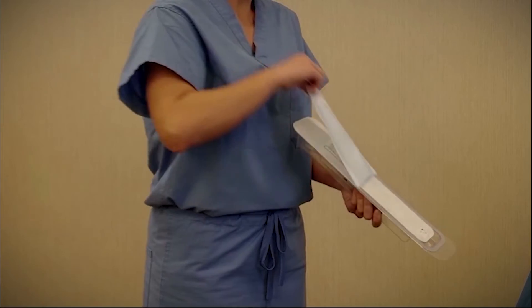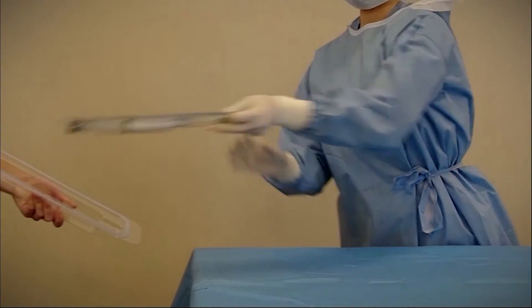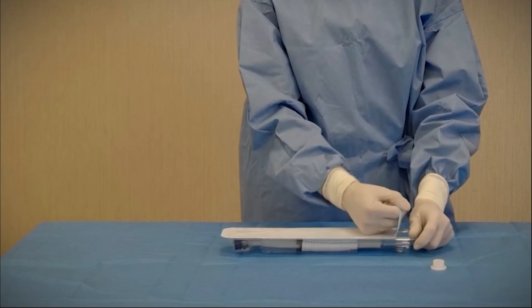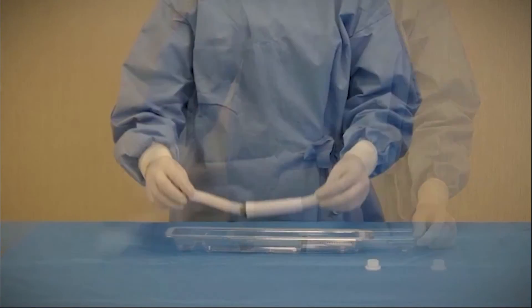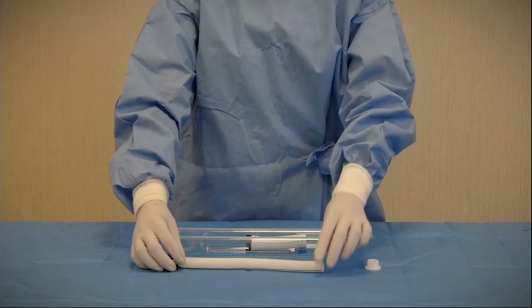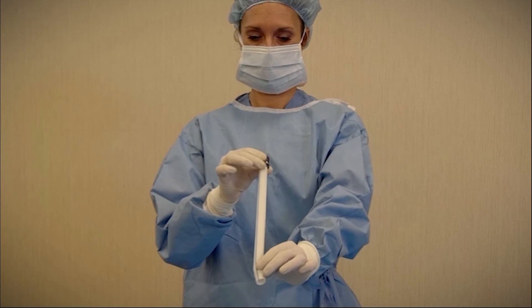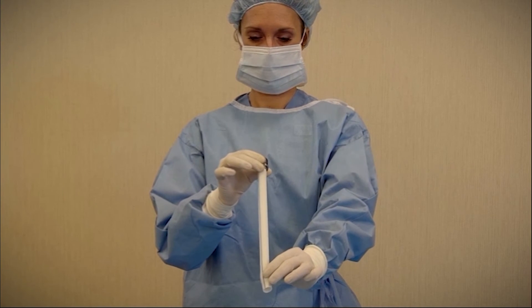Next, pass the sterile inner tray containing the graft and bend relief into the sterile field. Open the inner tray. Slide the bend relief off of the graft and place it back into the tray. Inspect the interior of the graft and remove any particulate that may be present.